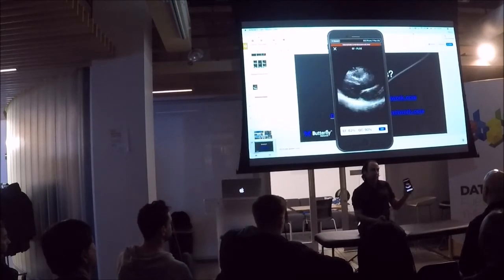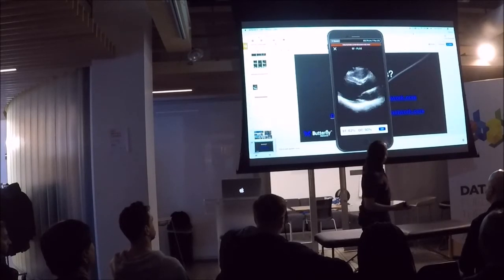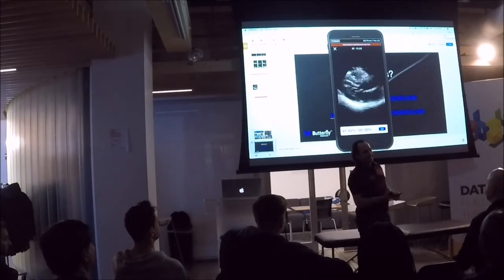Was that done processing on the device? Everything is done on device in real time. So you can be offline? Correct, there's no cloud. Except if you want to show this during a lecture.